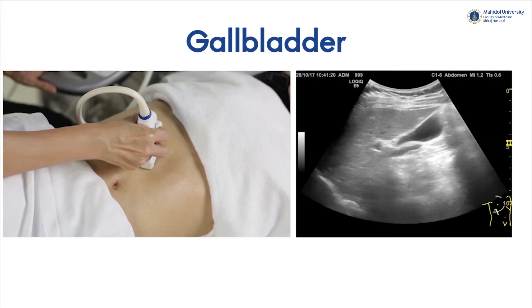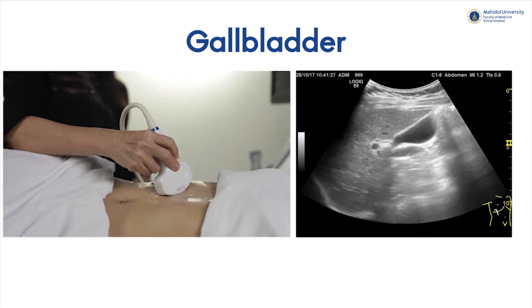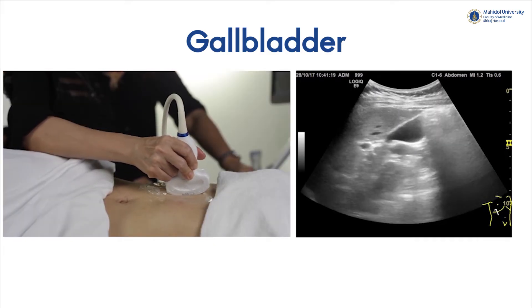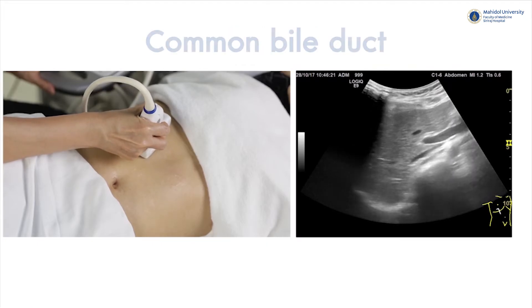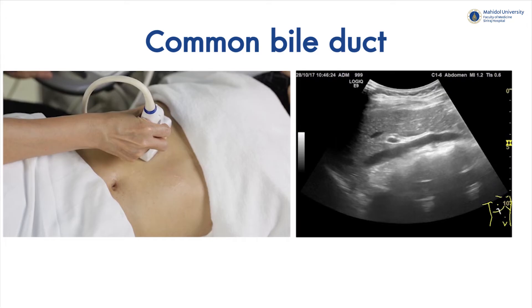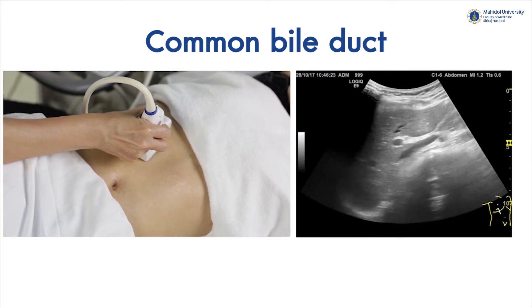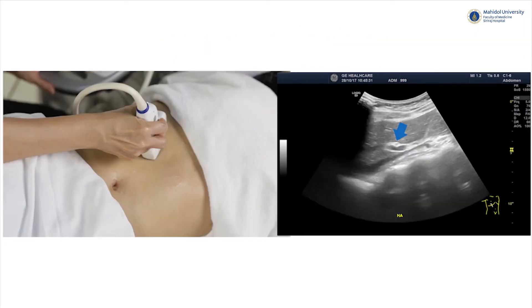For the gallbladder, it normally locates at the gallbladder fossa lying between the left and right lobes of the liver. A well-distended gallbladder will show intraluminal fluid echo — anechoic — and has a thin wall of around 2 to 3 mm in thickness. The common bile duct (CBD) is normally seen at the porta hepatis, aligning along the main portal vein. Placing the probe perpendicular to the subcostal area will usually give you the best view of the CBD, which normally locates anterior to the portal vein, with a normal diameter not exceeding 7 mm. The small round structure intersecting with the CBD is the hepatic artery.